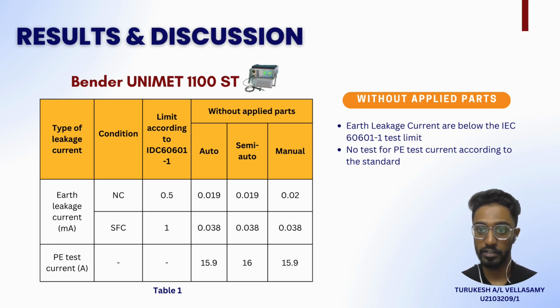The electrical safety test is conducted on the assigned medical device, which is Bioimpedance Boca, using Bender, Rigel, and the self-designed measuring device in 4 different modes. Bioimpedance Boca is analyzed under normal condition and single fault condition. The single fault condition for earth leakage current is open neutral, while the single fault condition for enclosure leakage current, patient leakage current, and patient auxiliary current are open.